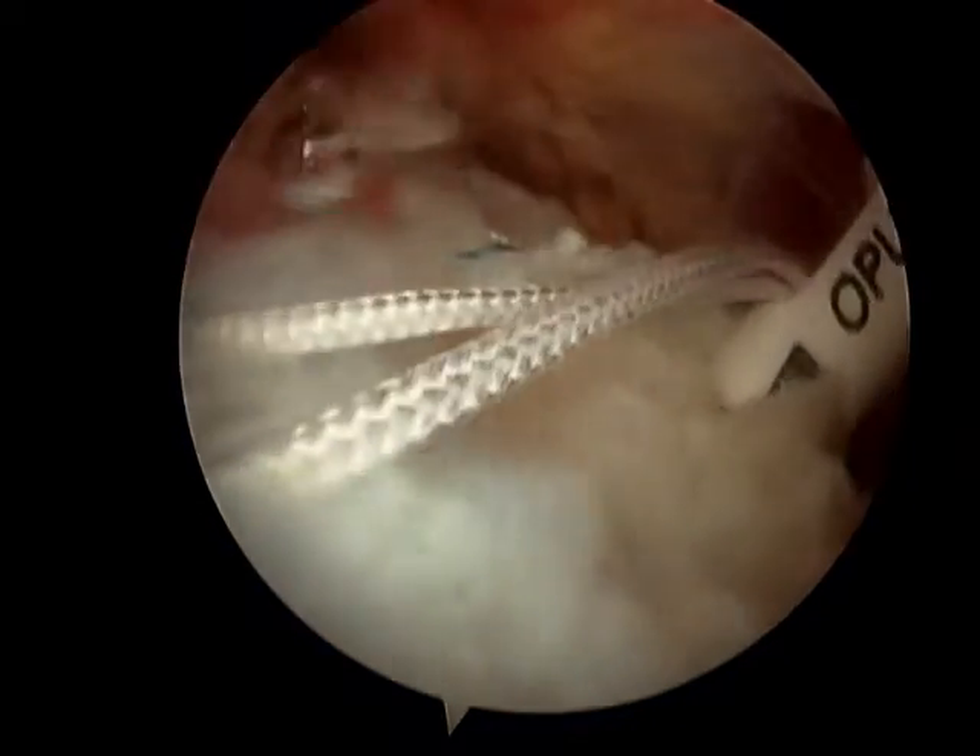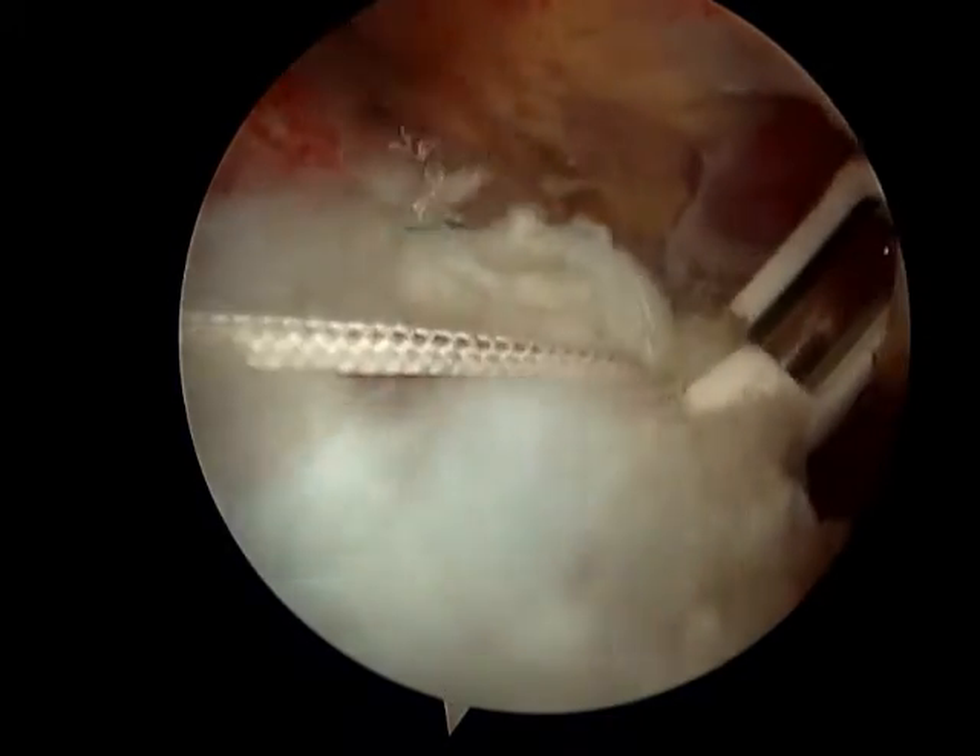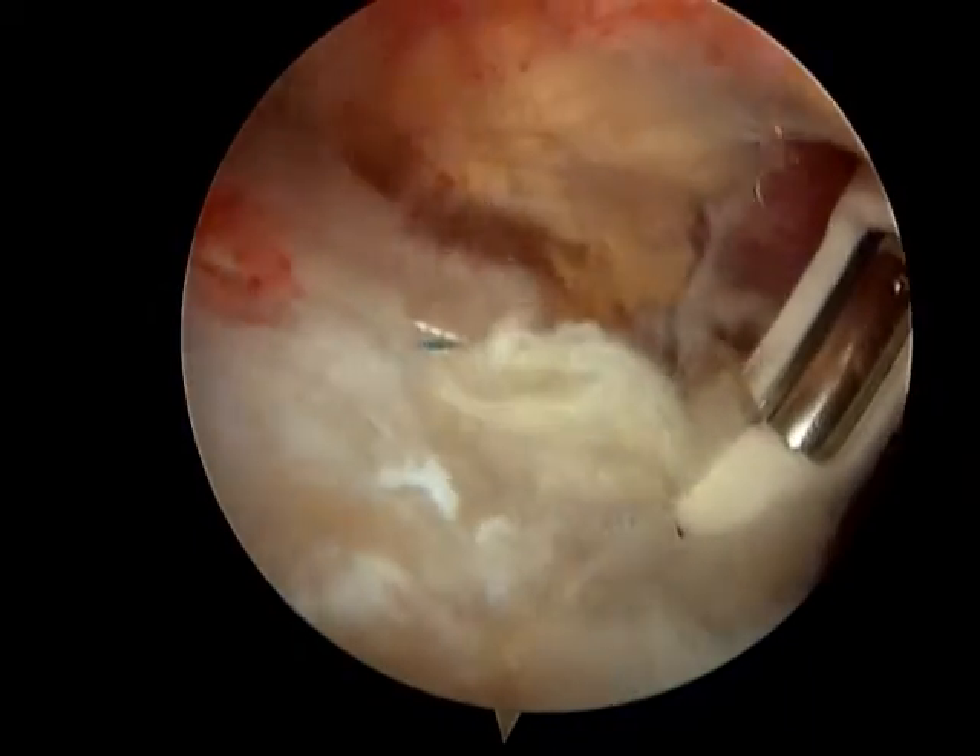Making a hole, putting the suture in the anchor, and repairing the tendon under direct vision.